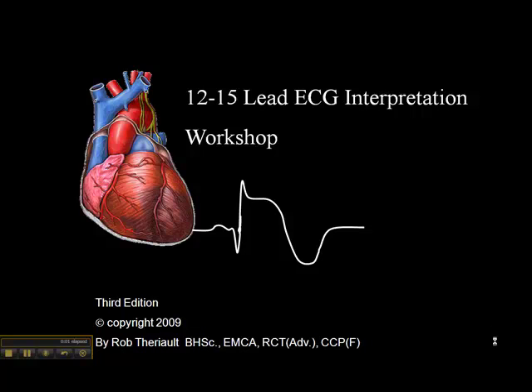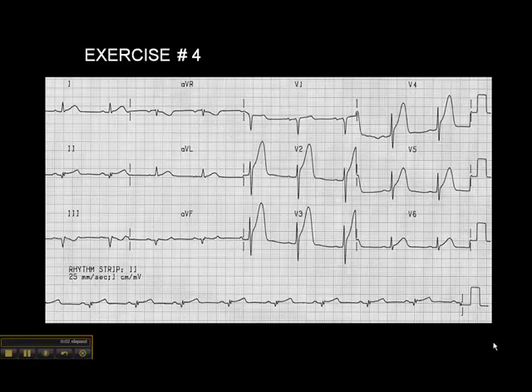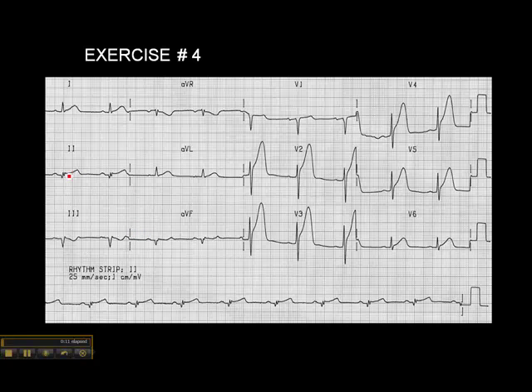Now let's look at exercise 4 on page 42, and again, following the same sort of process, looking at the ECG from left to right, we look at lead 2. Do we see ST elevation there? There might be a millimeter here.